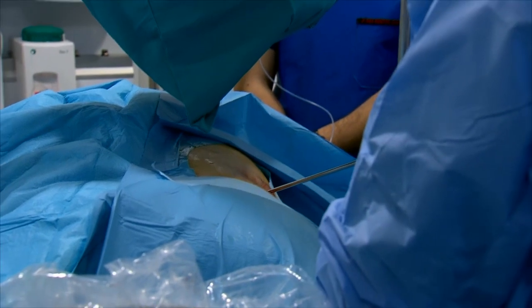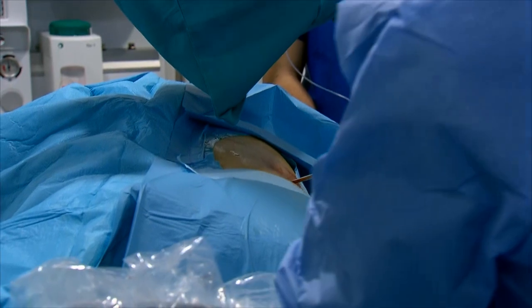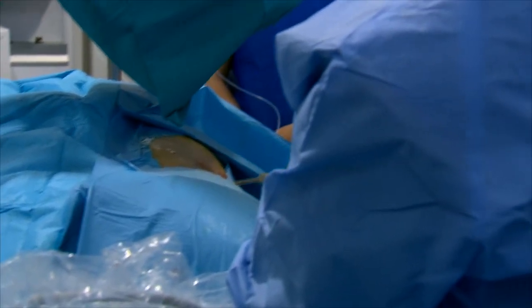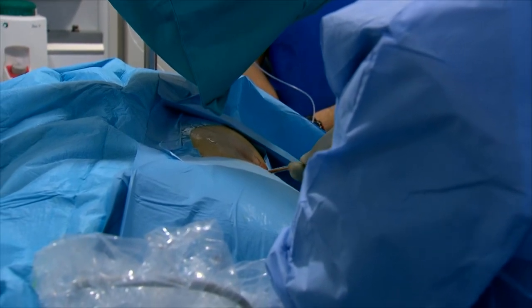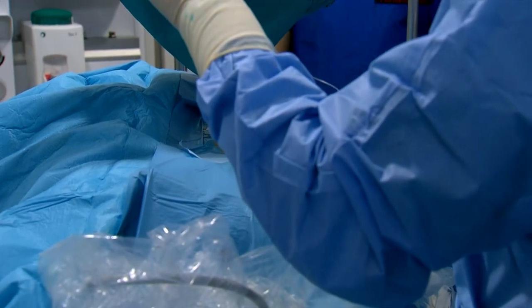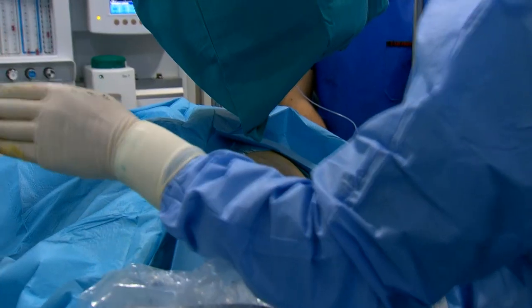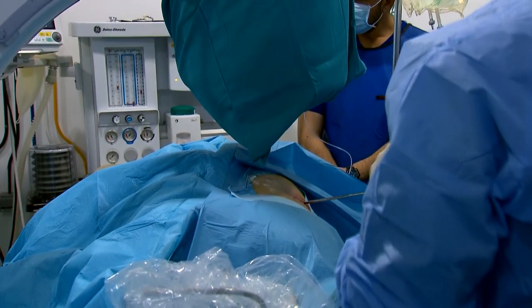Yes, continue. Always turn it around. Great, okay, stop. Perfect. A short x-ray, please. Both views. A short picture, please. Okay, stop. Now we have a clear picture.